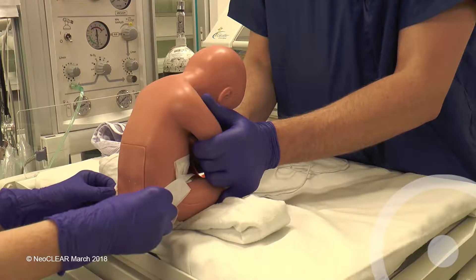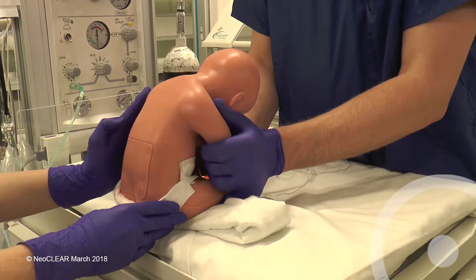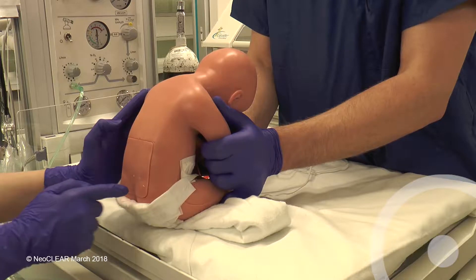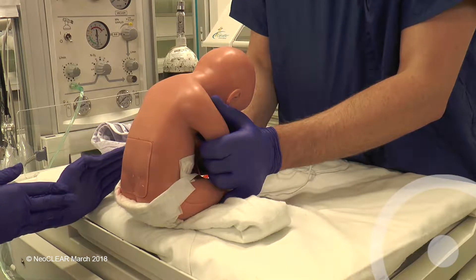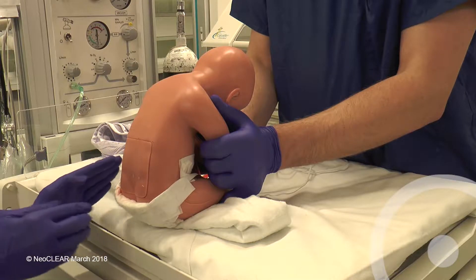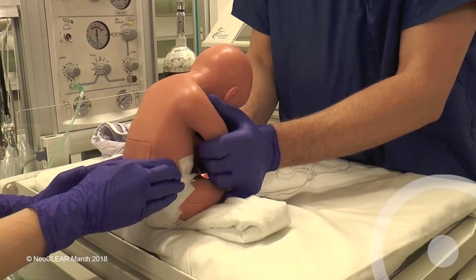Operator and first assistant should be happy with the height of the bed and that the baby can be held correctly. Pull the nappy out of the way. For a sitting lumbar puncture, the infant should be held upright with the spine curved forward but straight in a vertical line. The knees and hips should be flexed as much as possible and the head allowed to rest forwards on a folded sheet or towel if needed.